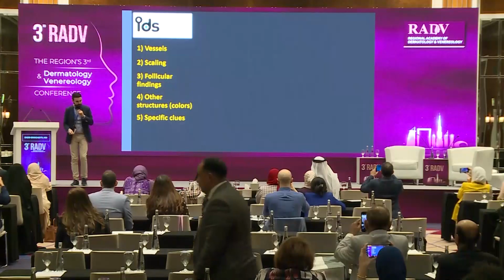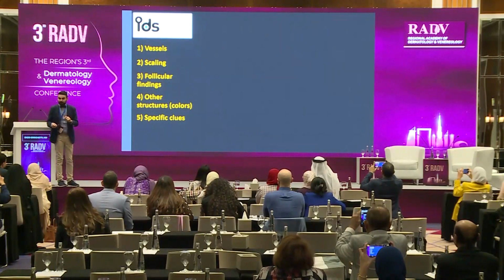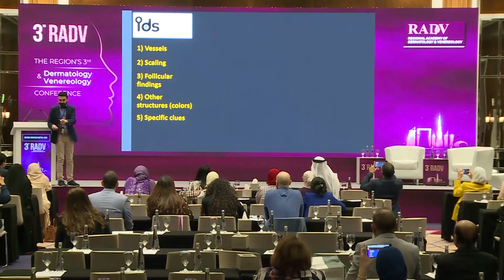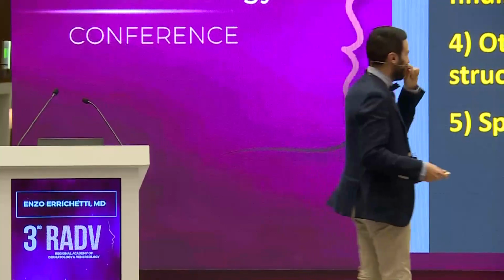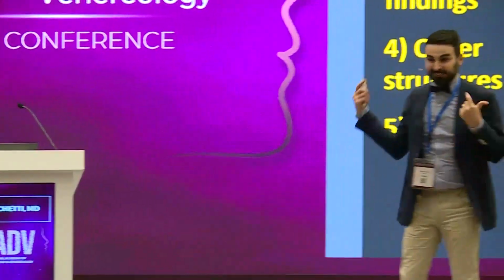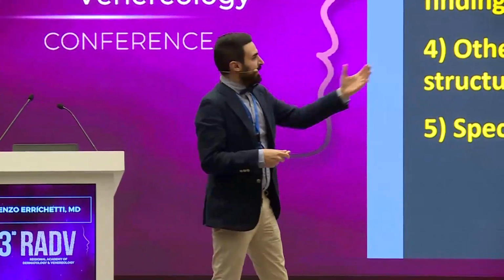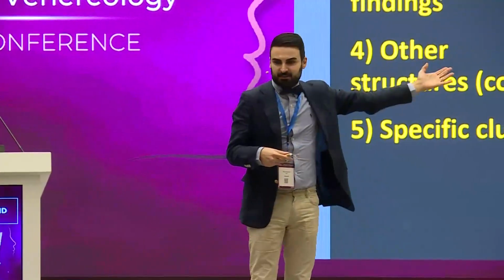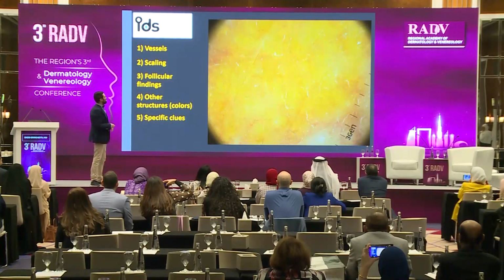Okay, so these are the 5 parameters. Which one is the most simple to be seen, in your opinion? Best colors. Good. Colors. Right. Otherwise, I would have changed the title. Yeah. Okay, colors. But yeah, I think that we all agree that this is pink. No, yellow. Okay, okay. Perfect.